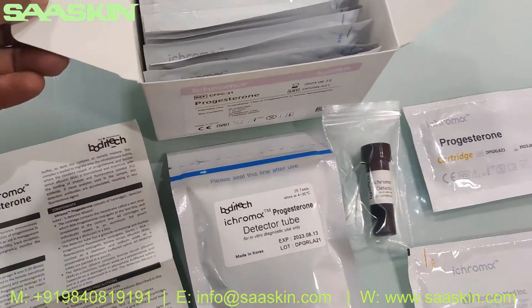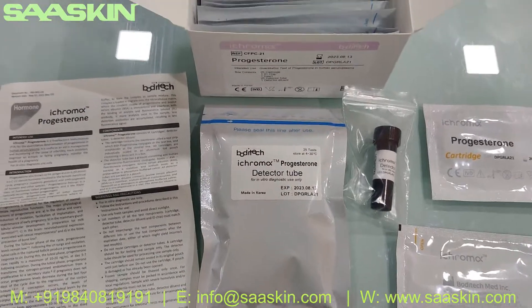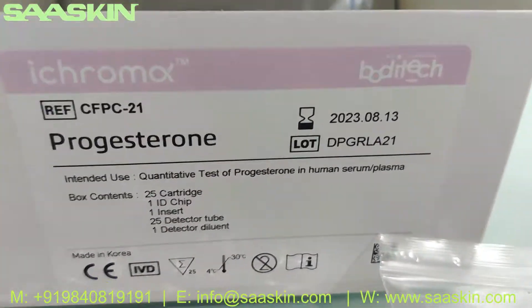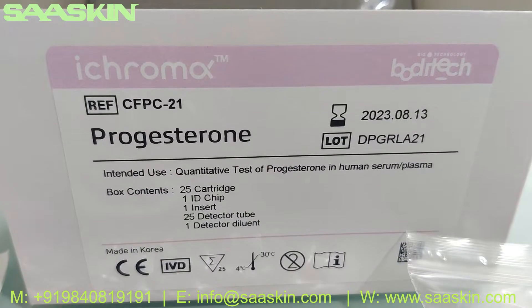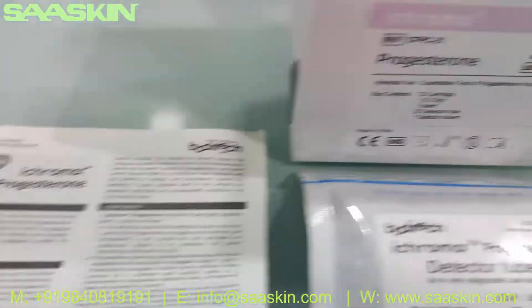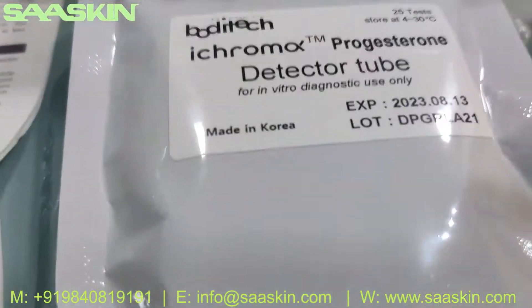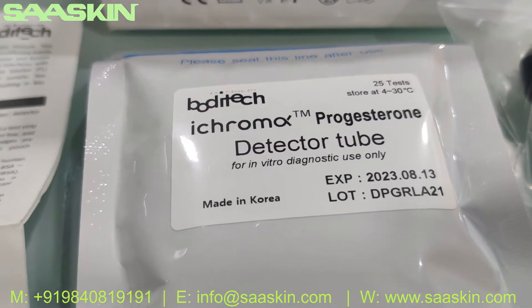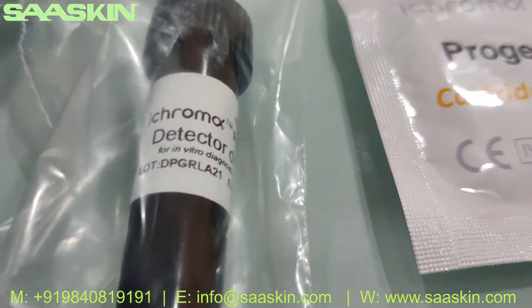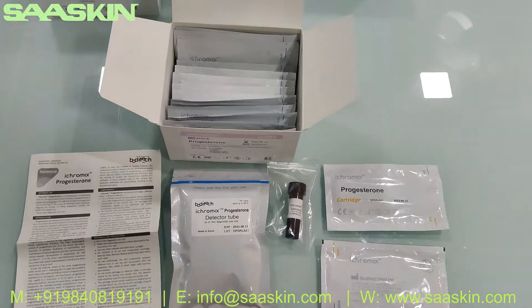To give you a quick summary: this kit has to be used along with the iCHROMA2 analyzer instrument. This is the iCHROMA 25-test kit pack for the PROGESTERONE test in human serum and plasma. It contains 25 test kit cartridges, an IFU brochure which is a complete instruction manual, one ID chip, 25 detector tubes, the test cartridges, and one detector diluent buffer. This is the complete test kit.